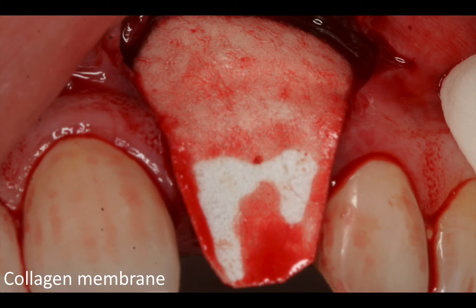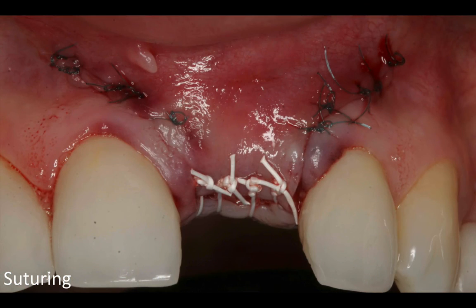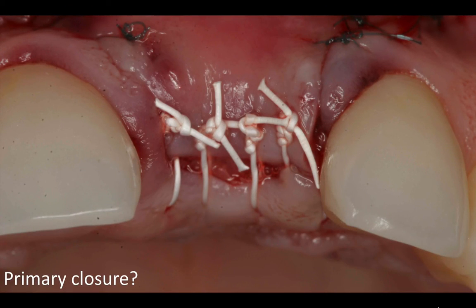First of all, it's much easier when you keep everything separate. The membrane doesn't run away and it doesn't fold on itself. And number two, it doesn't force me to get primary closure when I suture, which I did in this case. The occlusal part of the socket and the vertical releasing incisions are primary closed, because I needed to make sure that the membrane covering the buccal and the occlusal part of the defect is not exposed. And it's certainly doable, but at the moment it's not recommended.